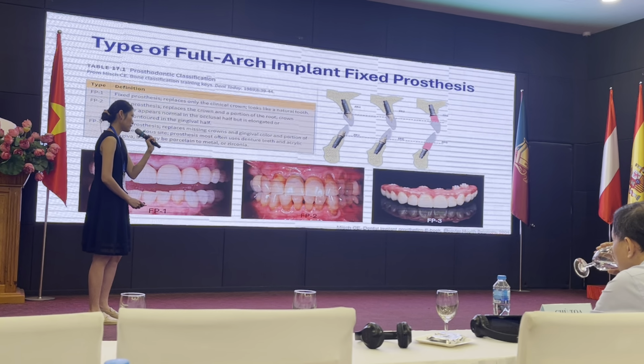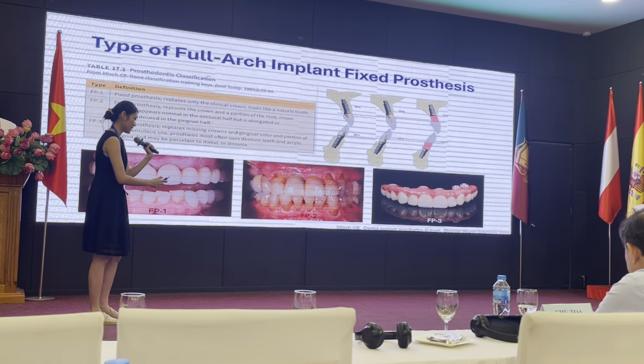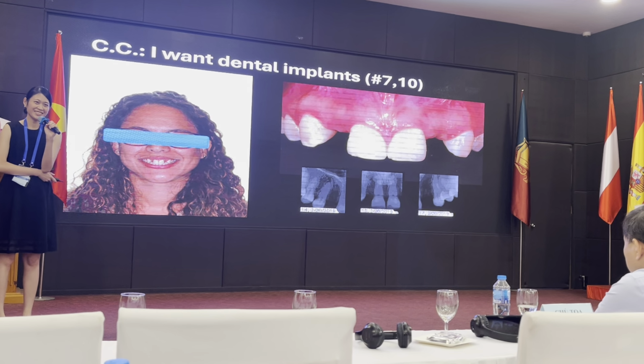But also you want to replace the soft tissue, meaning the prosthesis will have both teeth and artificial gingiva. Okay, and that's going to cases.